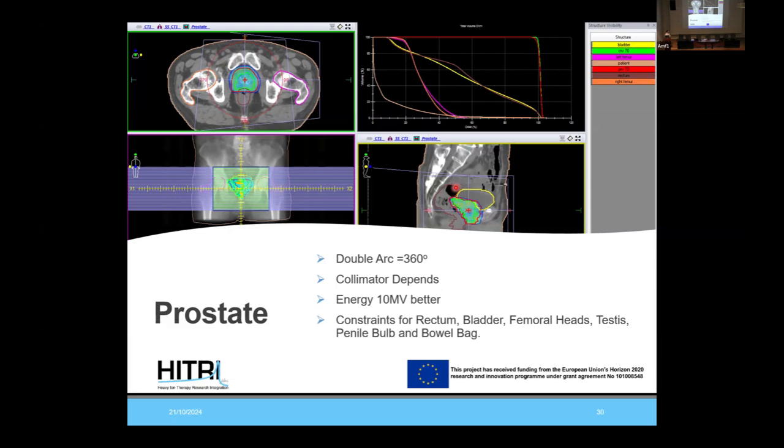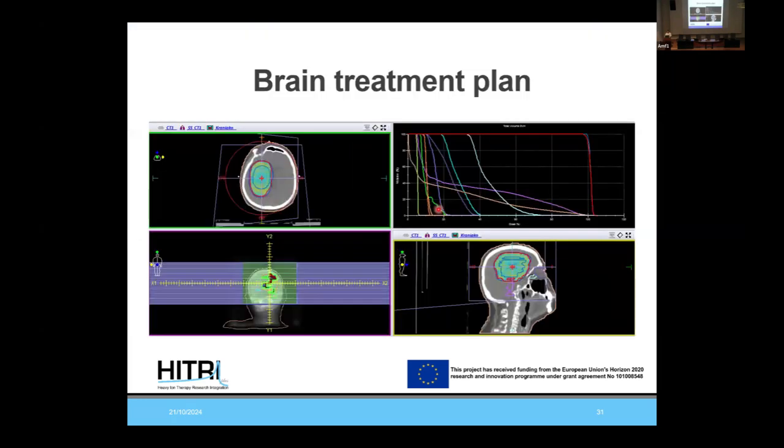The dose travels here, and we are not sure that we are going to irradiate the PTV properly, and whether there will be reproducibility of the plan. Maybe the patient will come 10 days later, and the bladder is smaller, and the rectum is very small. So we have to adapt it. Okay. Basically, I'm finishing. Don't worry.